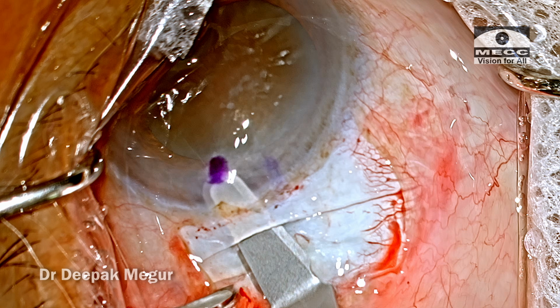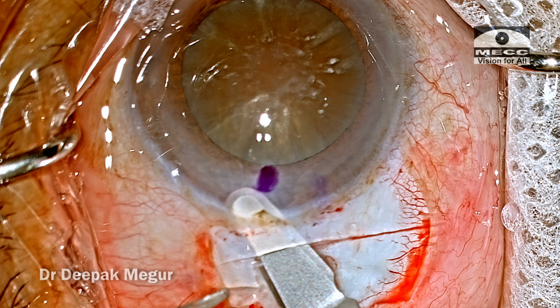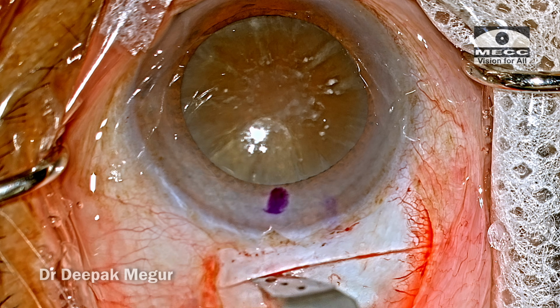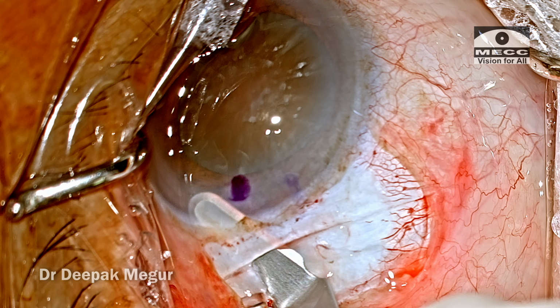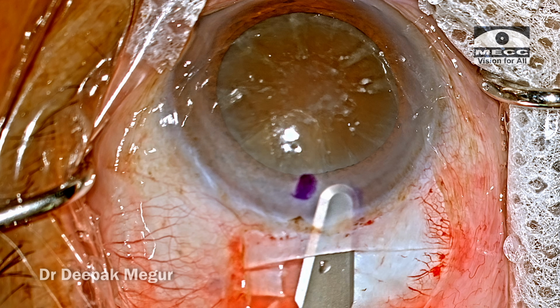And as I venture to the left side, we can see that the groove has been much more superficial than what my tunnel is. That's the reason why you have this shelving of the sclera which is happening. The solution is to come out and deepen the scleral groove, and then you continue with the tunnel. The same tunneling is continued on the right hand as well.